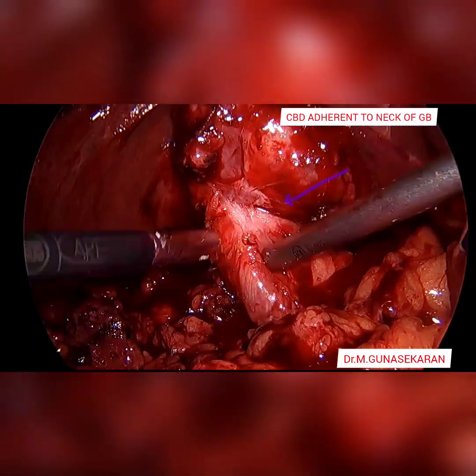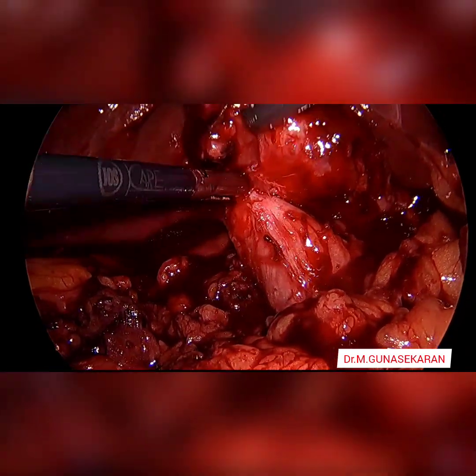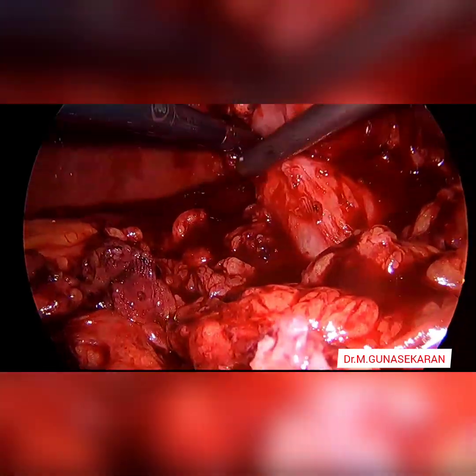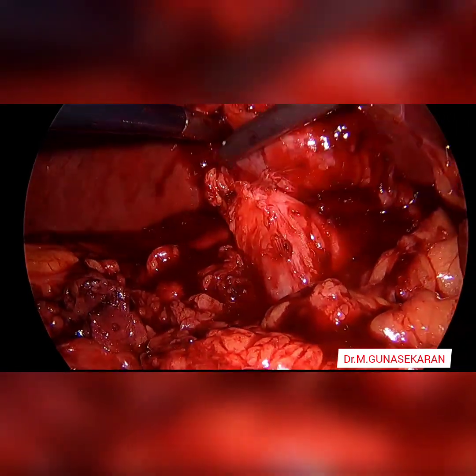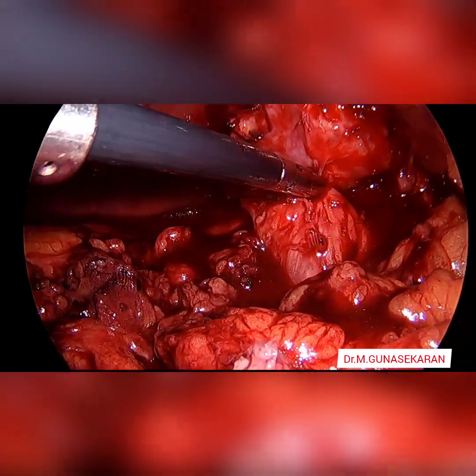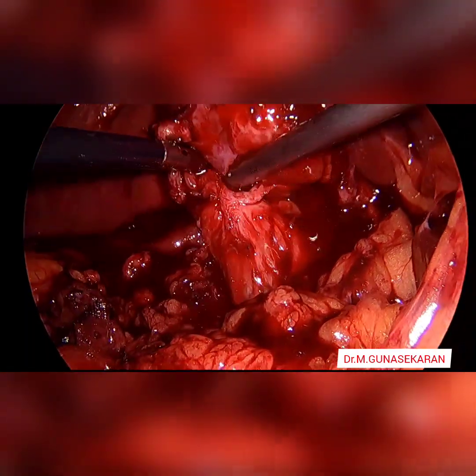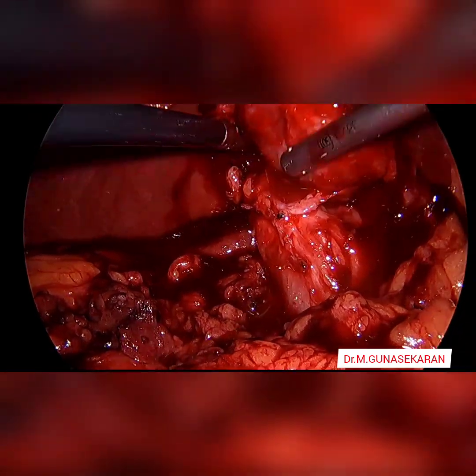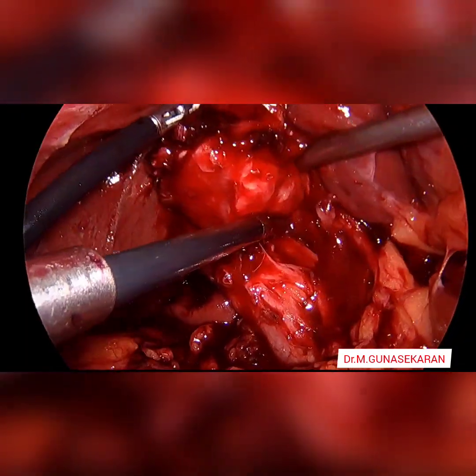Fortunately, there is no perforation between the stones in the neck of the gallbladder and the common bile duct. You can appreciate that there is a dense adhesion between the neck of the gallbladder and the common bile duct because of severe inflammation. Therefore, I have left a part of the gallbladder with the common bile duct.